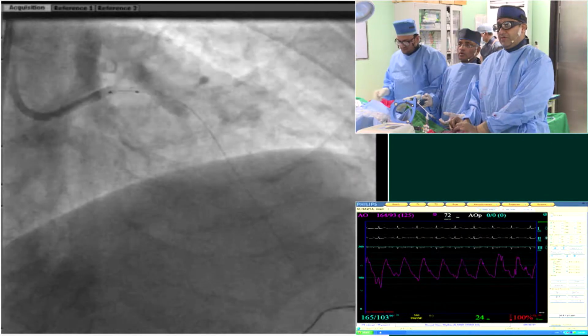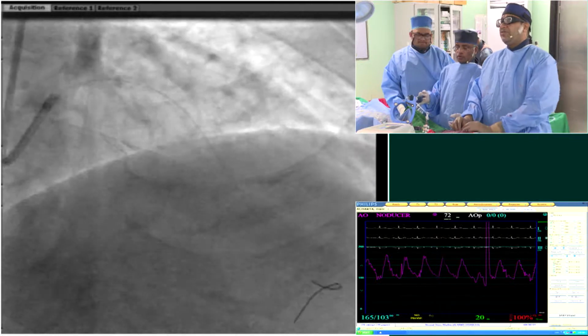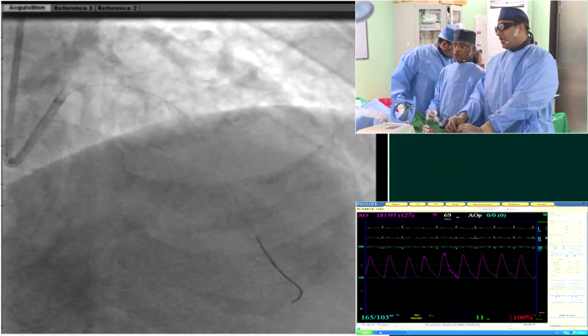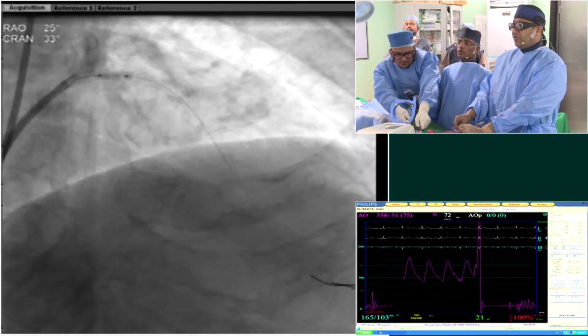And then you may want to replay the angio and see if there is a landing spot so that we don't cover the diag. We'll have to cover the diag, doesn't it close? So we'll take a shot again. Let's take a last shot. Show them the last shot. It'll be before the Flextome.